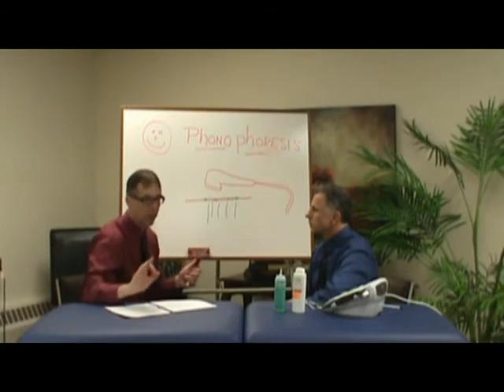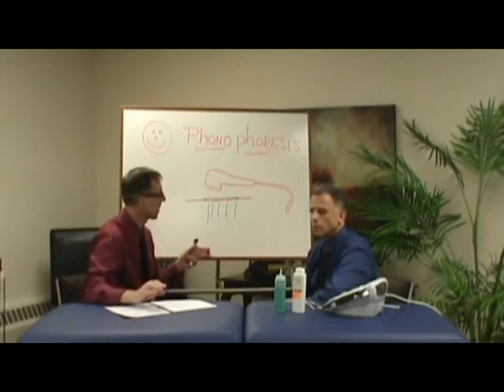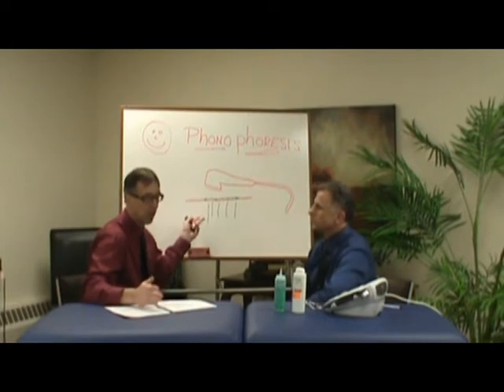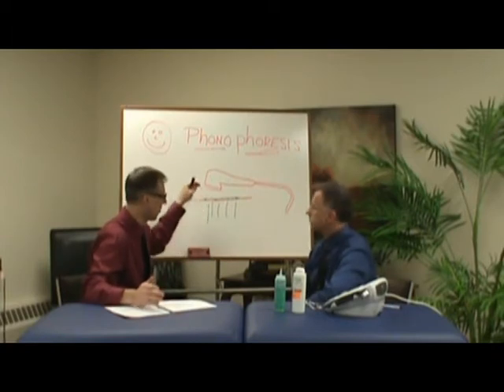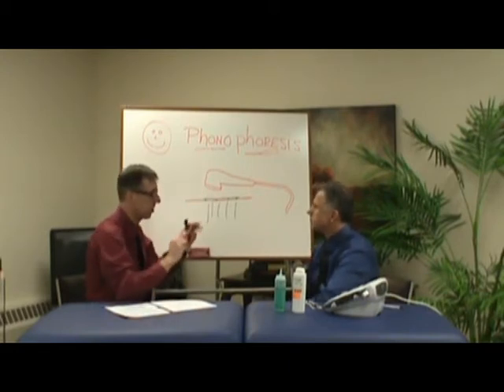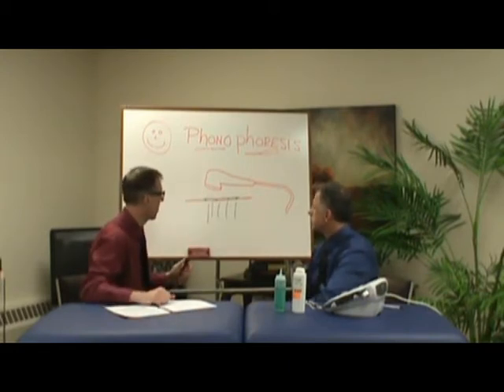It's very important what type of medicine you use, because certain medicines can work with the ultrasound, and certain medicines are better for driving through the skin. There's a certain combination that you need to fulfill both of those.